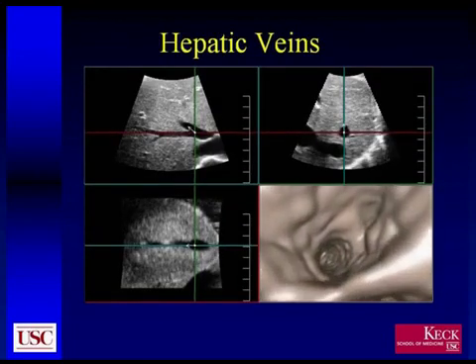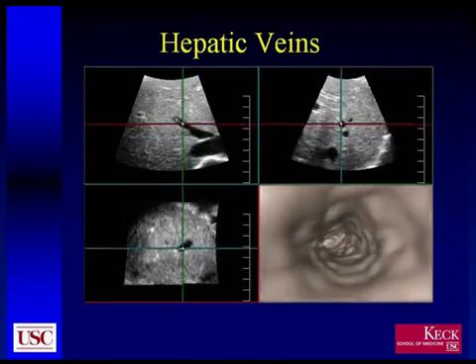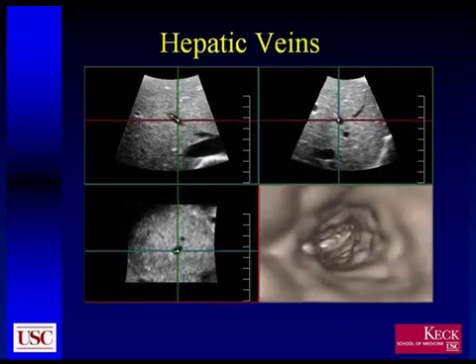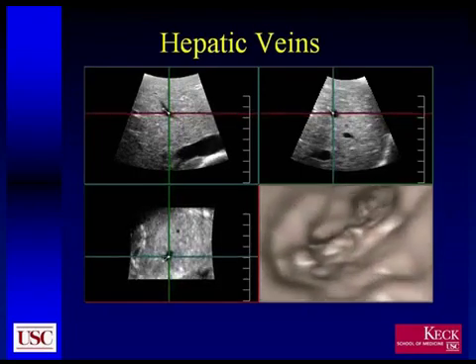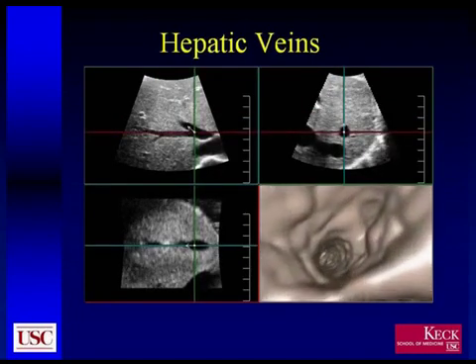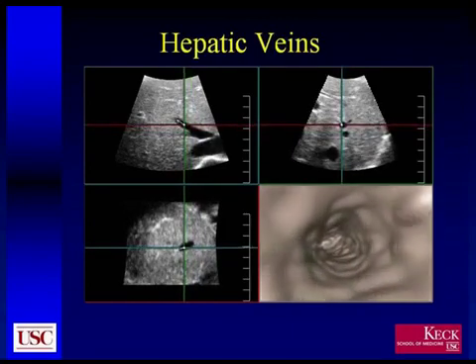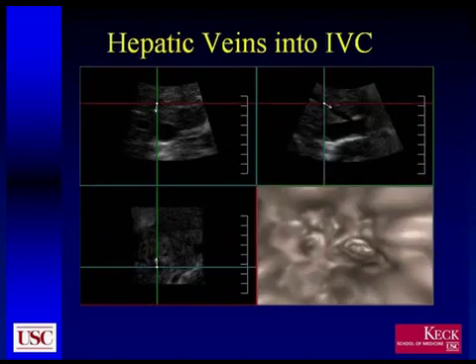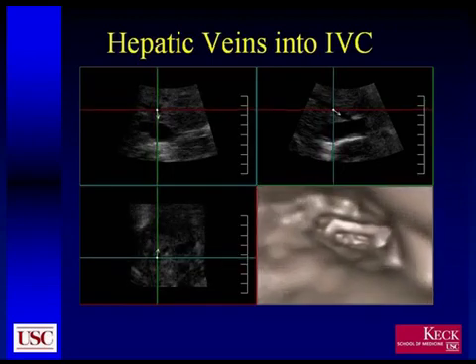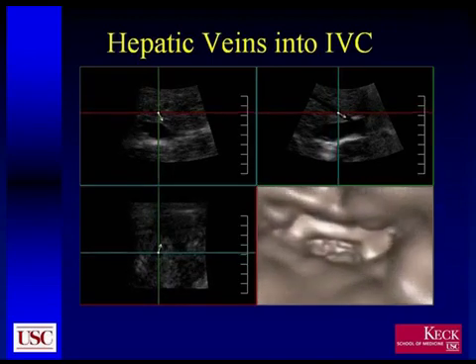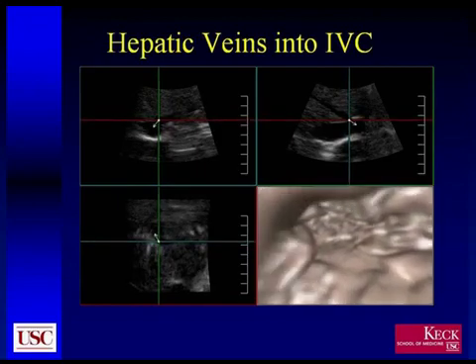This is a patient who has had a transplant, and you can actually see the vein dumping into the inferior vena cava. We directed this, and as you come out of the vein instead of going outward, you can sort of see us falling into the larger structure of the inferior vena cava. For TIPS, most of the stenoses occur in the area of the hepatic veins, and typically the only way we diagnose this is by looking for Doppler velocity abnormalities. Here you actually have a real-time image showing the anatomic structure of the TIPS and the ensuing hepatic vein.